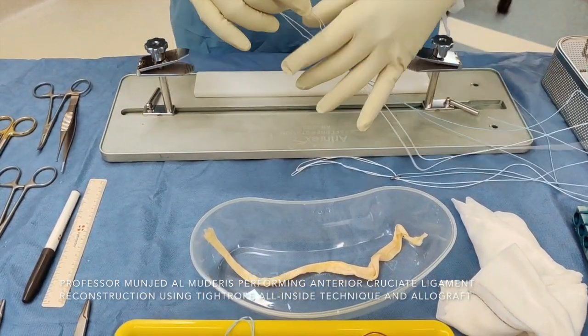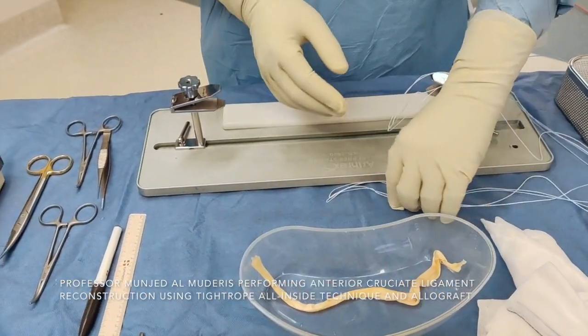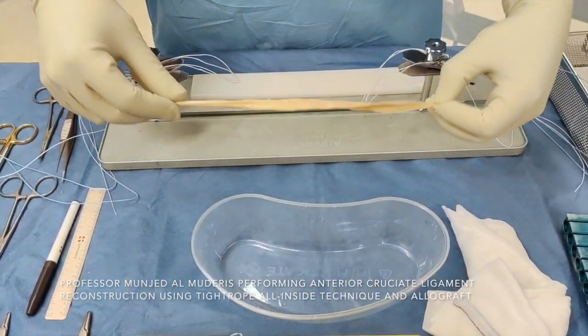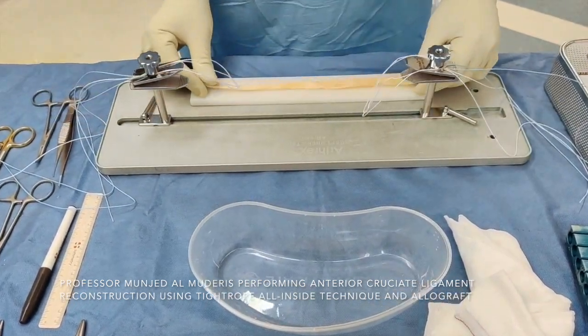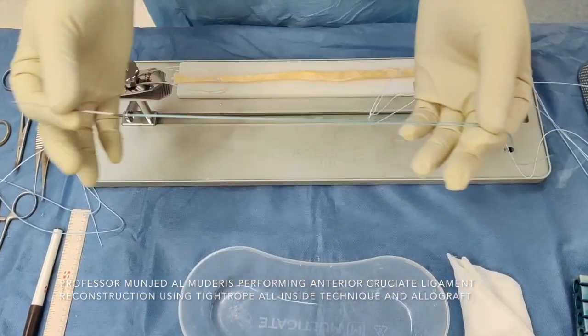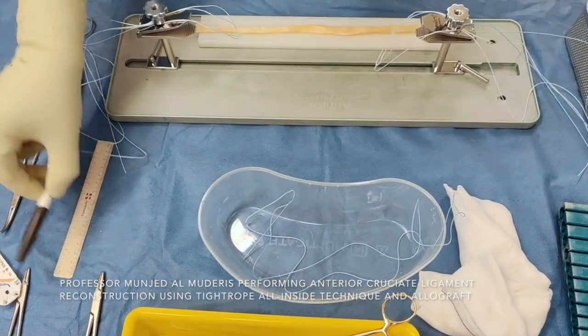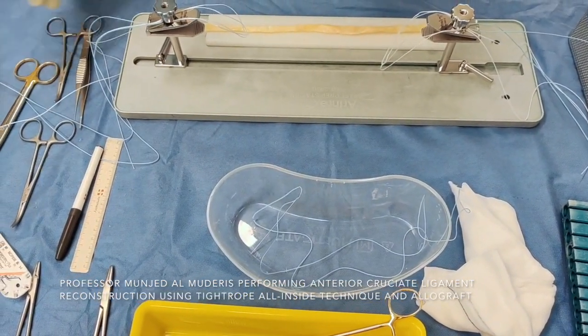For the graft preparation, I need two tight ropes, one on each end of the graft preparation station. This is an allograft, most likely to be tibialis posterior tendon. What I use is a straight needle whipstitch loop suture, but you can use any kind of suture. You also need a 3-0 Monocryl, a marking pen and a few other instruments to hold the graft.